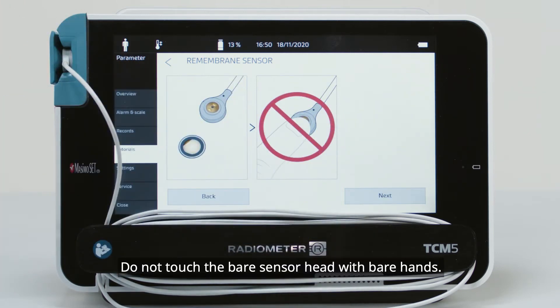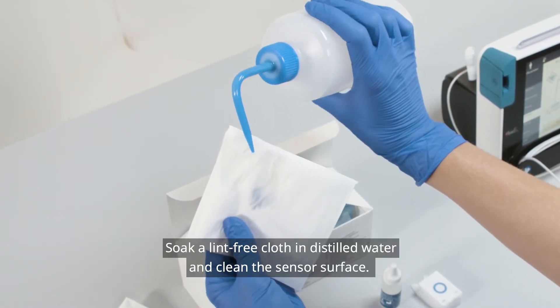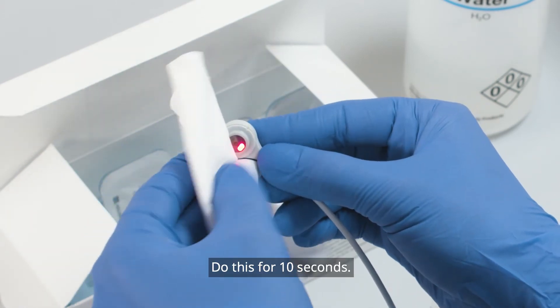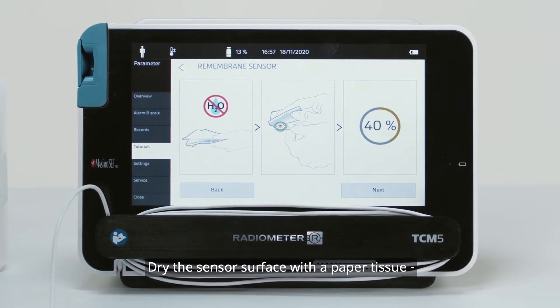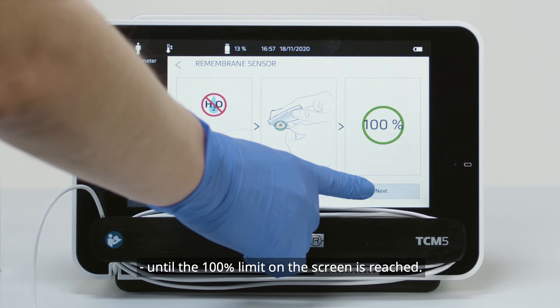Do not touch the bare sensor head with bare hands. Soak a lint-free cloth in distilled water and clean the sensor surface. Do this for 10 seconds. Dry the sensor surface with a paper tissue until the 100% limit on the screen is reached.